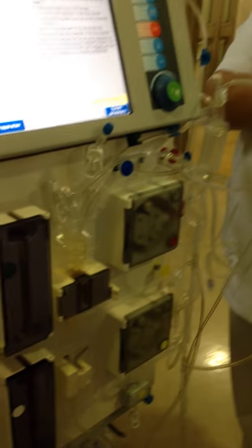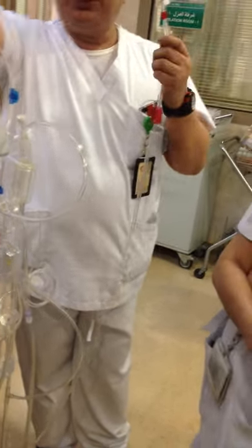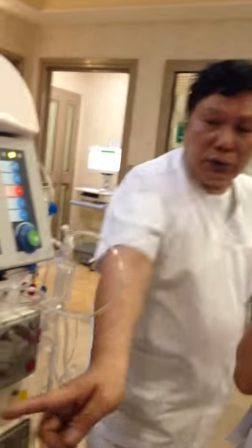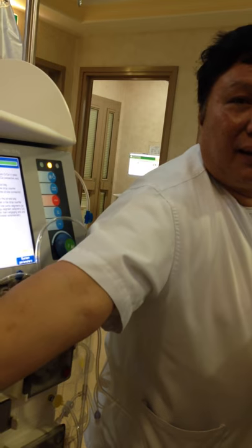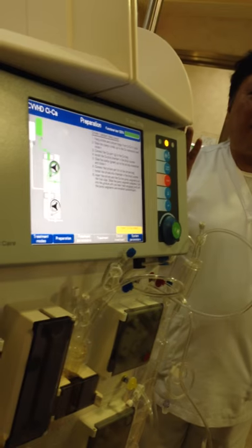Now, the reason Marlene was asking, why do we have to clamp? Because if you have a saline in here that you spike, and this clamp is open, it will go to the citrate. Very good. Then you get lost.